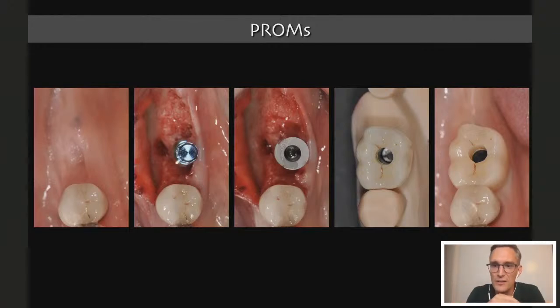And that's actually an advantage. But most scan bodies are made out of PEEK material, and I agree, there we can take a radiograph, but we don't see if the scan body is properly seating on the implant. And that's important, because if it's not seating properly, then you can take the best scan and have the best dental technician.